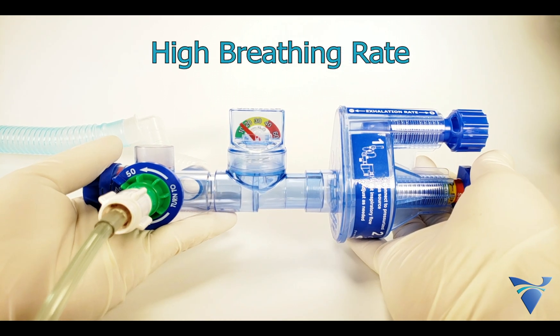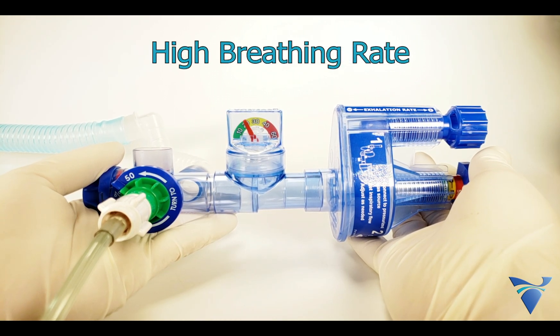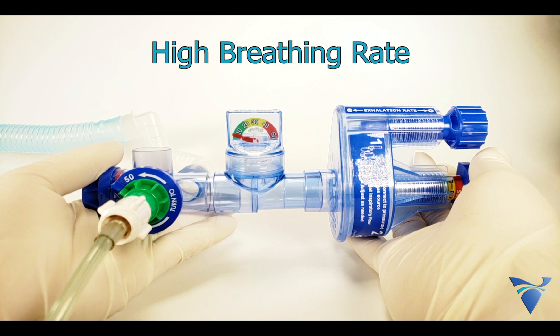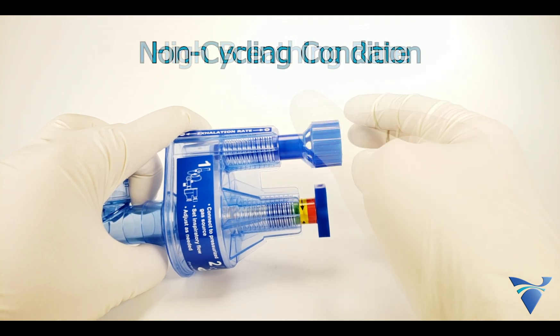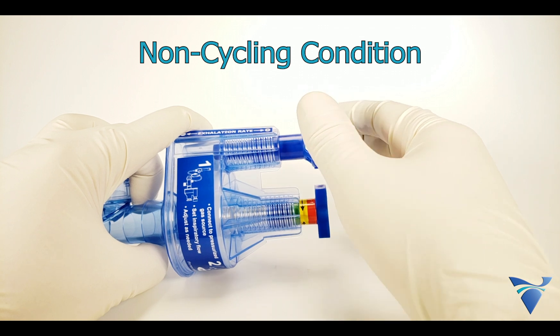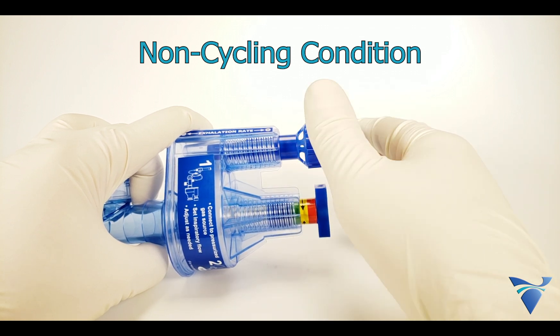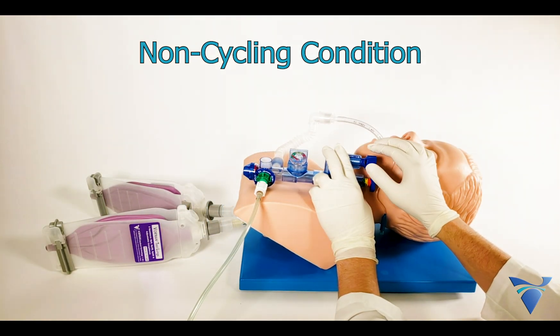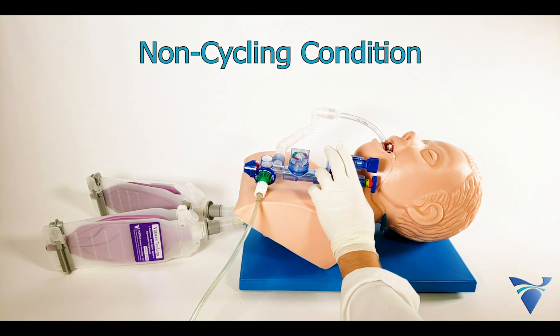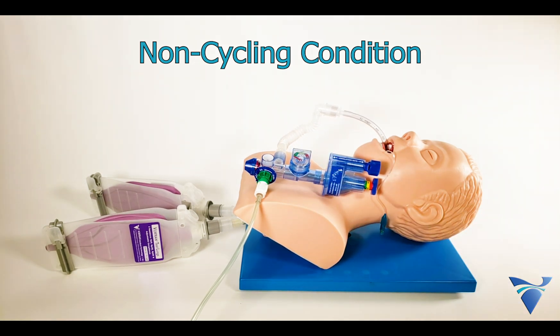Always ensure that the breathing rate is not set too high. The cycling of the GoToVent during inhalation and exhalation can be heard as well as visually observed on the manometer. Adjust the rate knob as needed to achieve the desired rate. In some cases, after adjusting the knobs, the device can enter spontaneous breathing mode where it stops automatically cycling. If all connections are secure and the device does not cycle, the rate knob should be backed out by turning counterclockwise until it enters pressure support mode and begins cycling again. The rate knob should be verified and readjusted as needed after any pressure or flow adjustments.